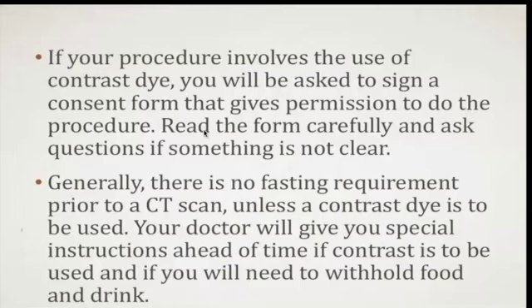So we will ask the patients to fill in a consent form so that we could share the responsibility with the patient and not carry the full responsibility on our own. We ask the patients to read the form carefully and ask any questions so that this becomes a correct consent form. And yes, you don't need any fasting for the CT, okay? Unless there is a contrast dye. So that's about it.